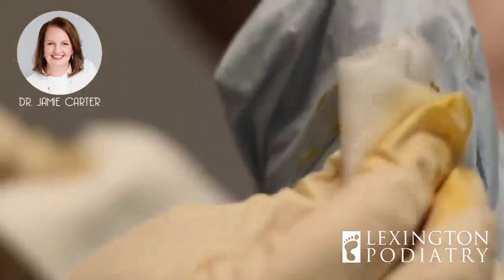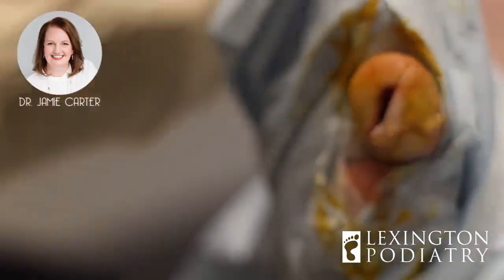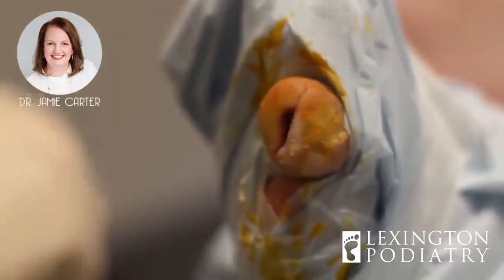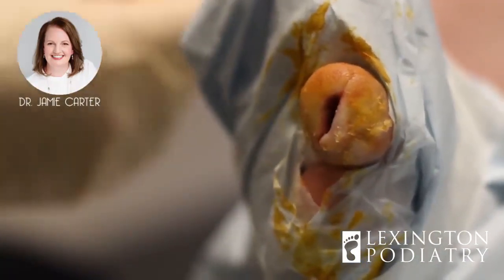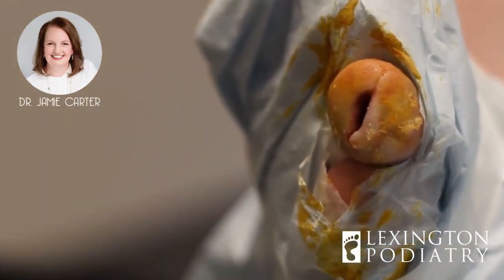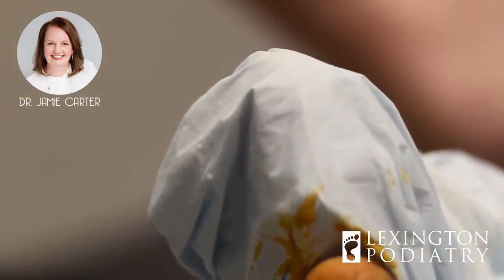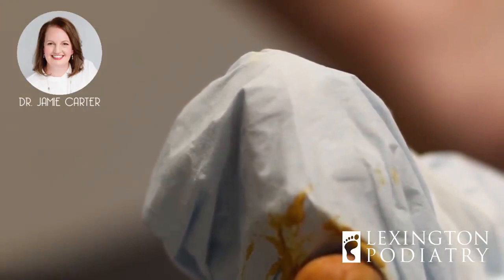Alright, we're going to put a retention stitch in it. And what that means is I'm just going to hold the skin edges together, but it'll still be able to drain out. Do we have sterile scissors too? I can go grab some. I'm going to put a piece of betadine packing down in there. That way the drainage will attach to it and it'll have a way to get out.